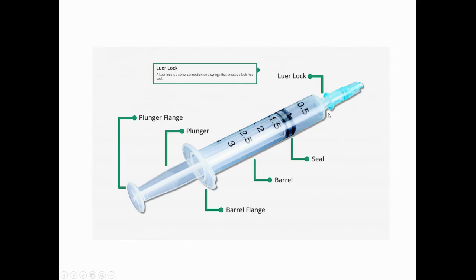So: the plunger, the barrel, the lock, then the needle.